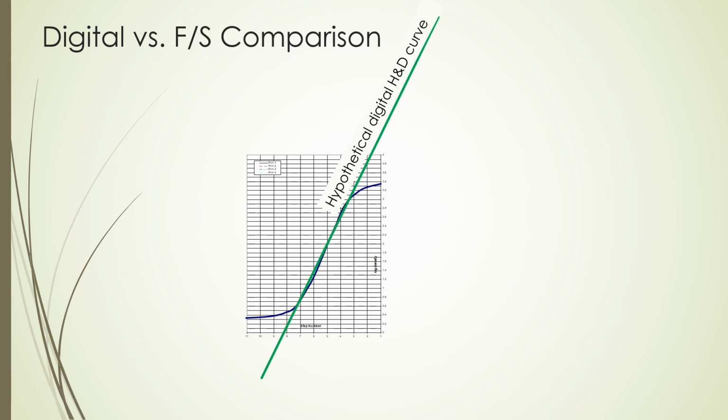Note that it extends above and below the film screen H&D curve, and there is not a drop-off or density change at the beginning or the end of the curve. There is enough density difference along its entire length that structures can be imaged if density is corrected by the computer.